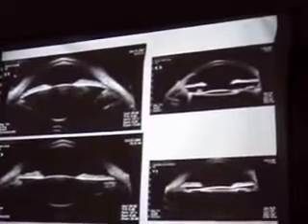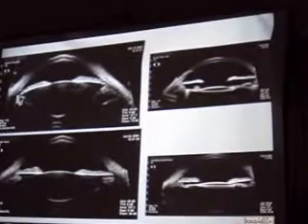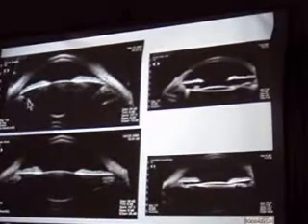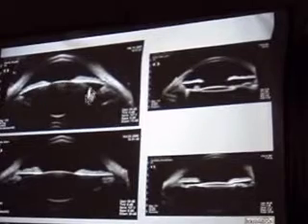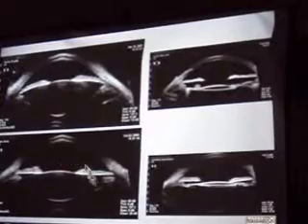But what about the standard IOL? And the standard IOL, look at the picture. These are the same 2 pictures before. Look at the position of the equator here and here.